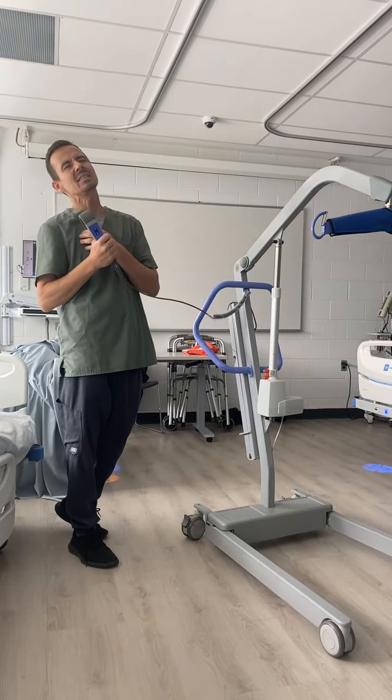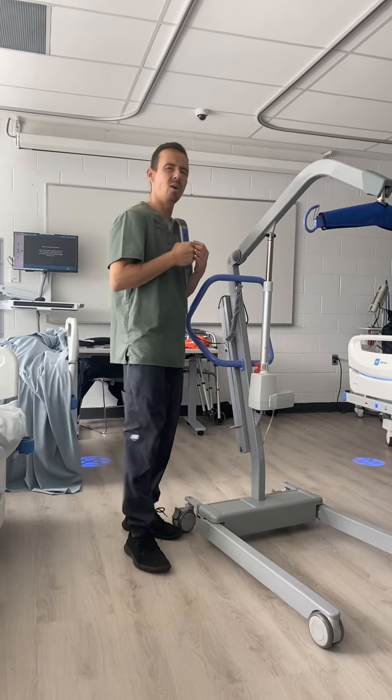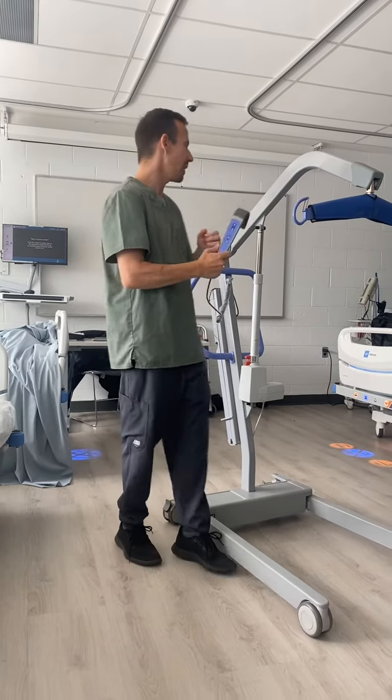And can you please not talk? I almost can't talk.